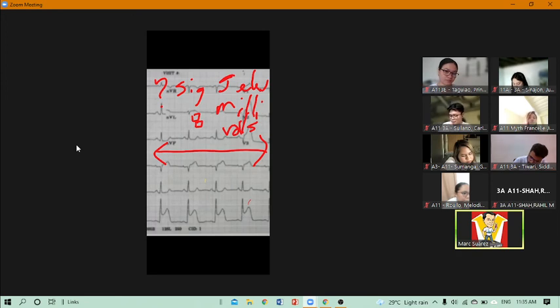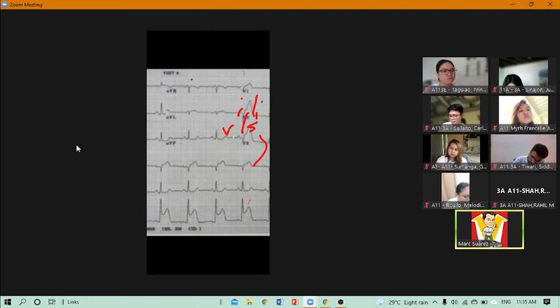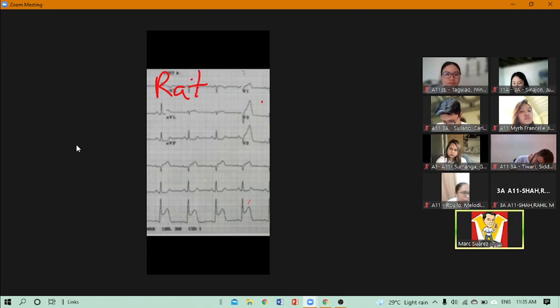Okay na? This Thursday, we will continue. We will determine the atrial rate and how to get the ventricular rate, right?